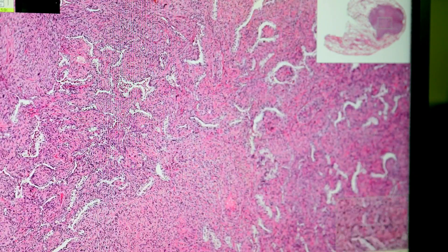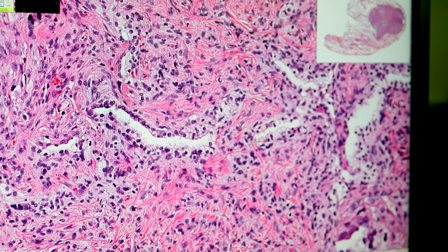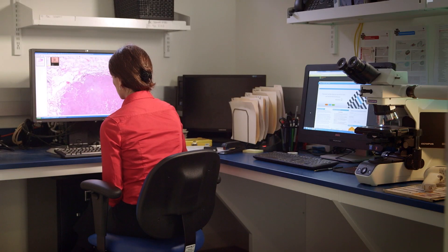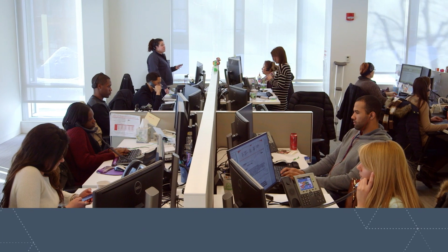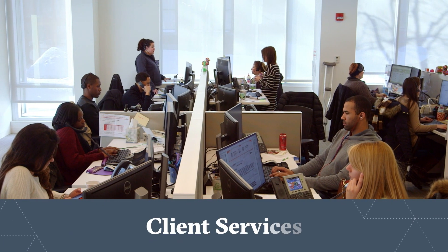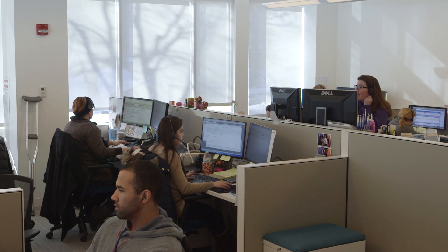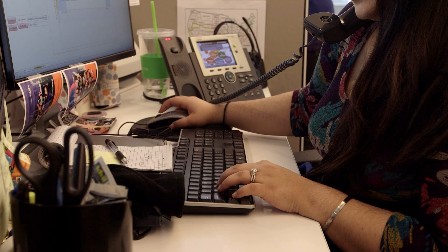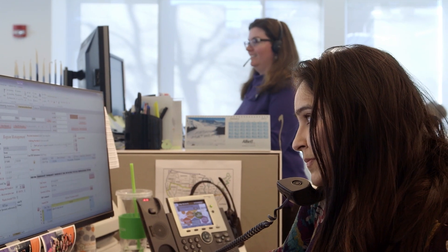About 92 to 94 percent of specimens have enough tumor tissue for testing and pass the pathology review process. If the sample does not pass our path review, our client services team will work together with the patient's pathology lab to identify alternative tissue sources and facilitate timely results to influence the patient's treatment plans.